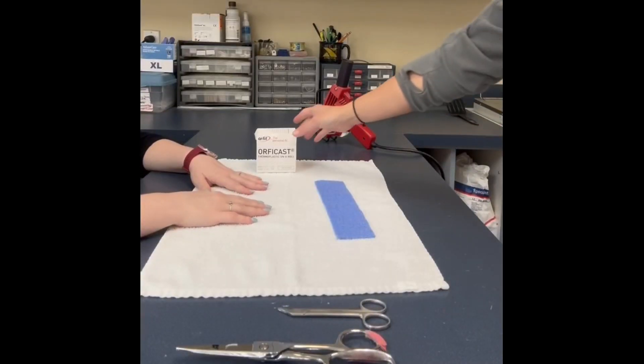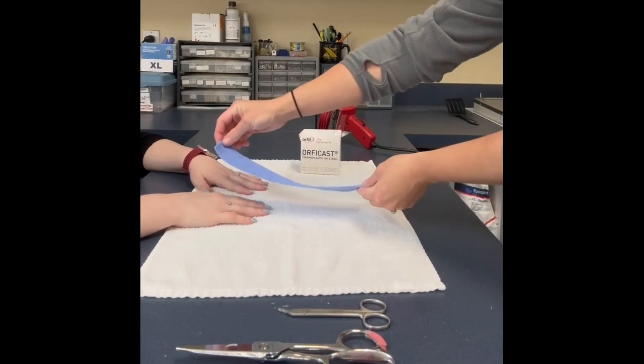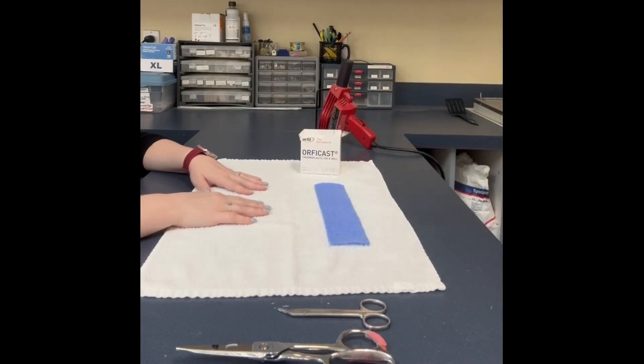First, you want to make sure you have all of your materials ready, which include 2-inch Orficast, a towel, a heat gun, splinting scissors, and small blunt-edge scissors.